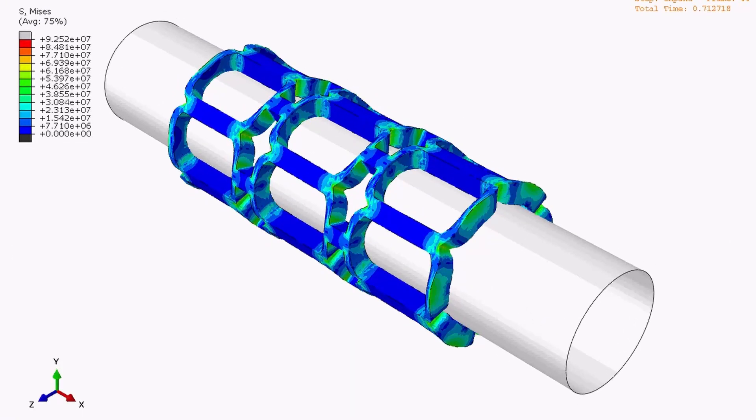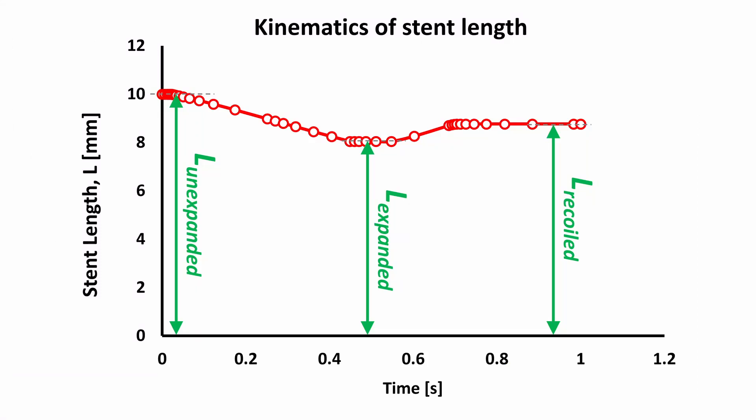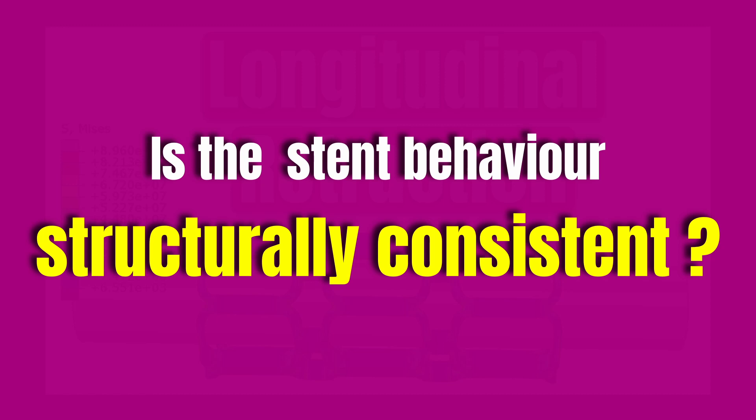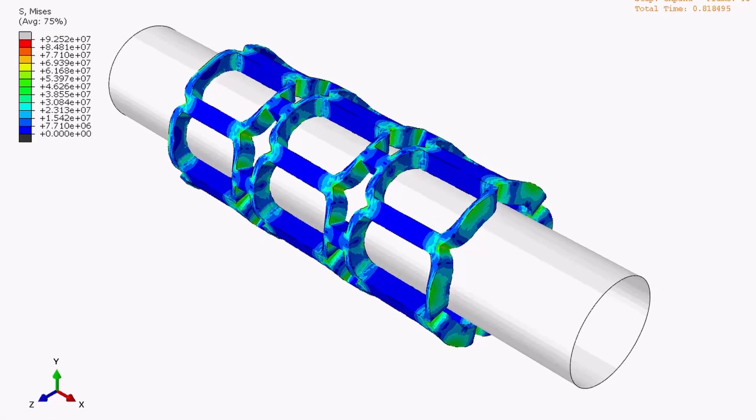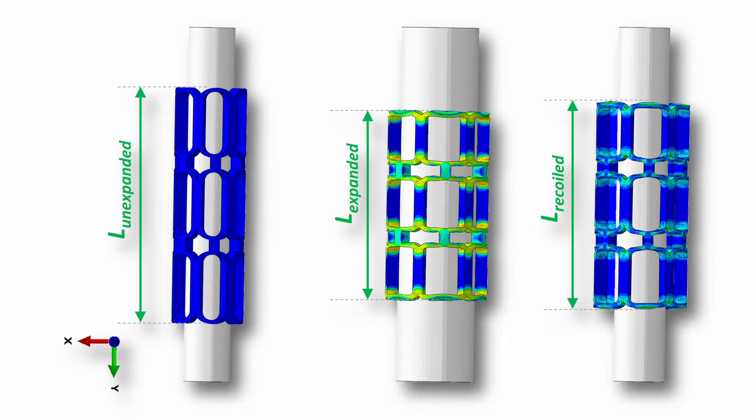You might have clicked on this video because you've just finished running your stent simulation, generated some excellent results, and want to know if the stent behavior is actually consistent with what you'd expect structurally. One of the parameters you need to use to do this is called longitudinal retraction. So this is what I want to show you in this video. Let's sit back and relax as we get started with this modeling.